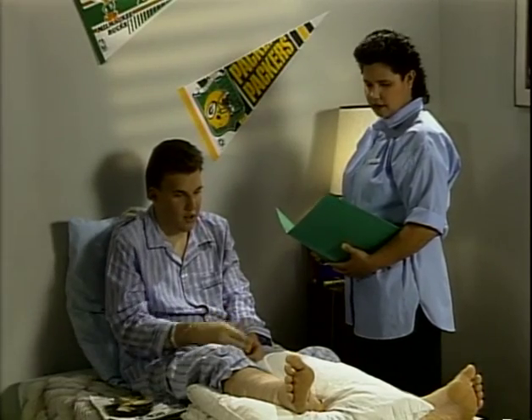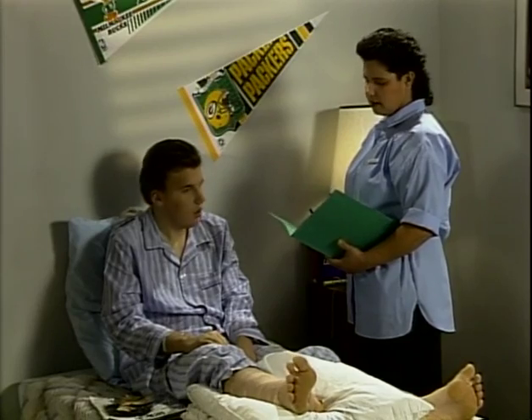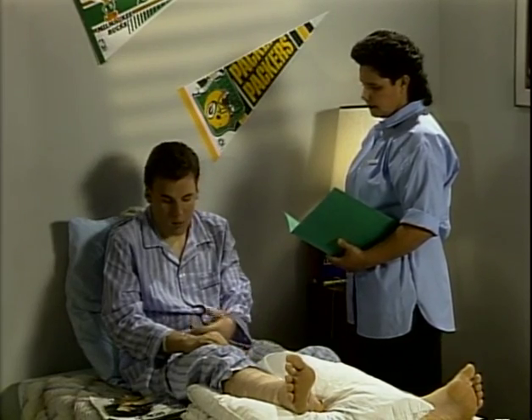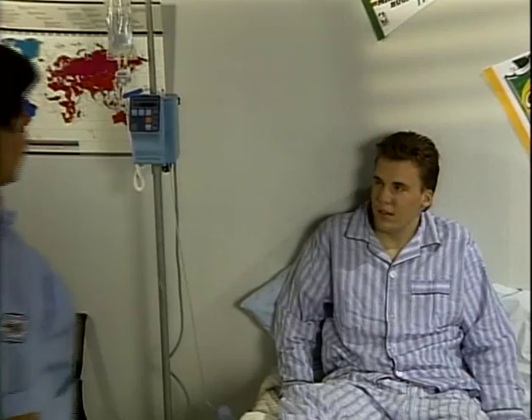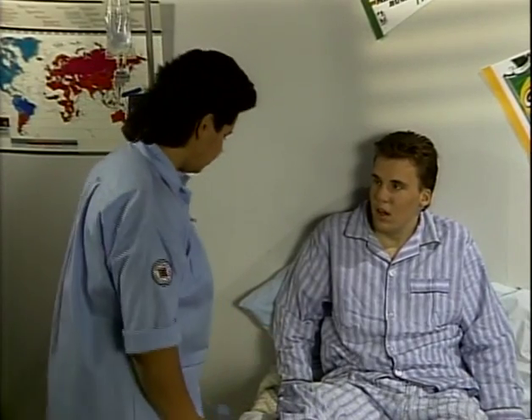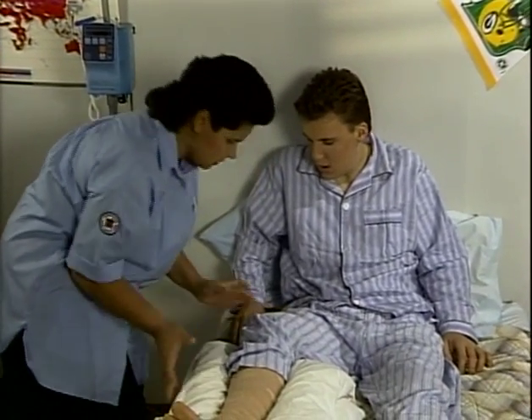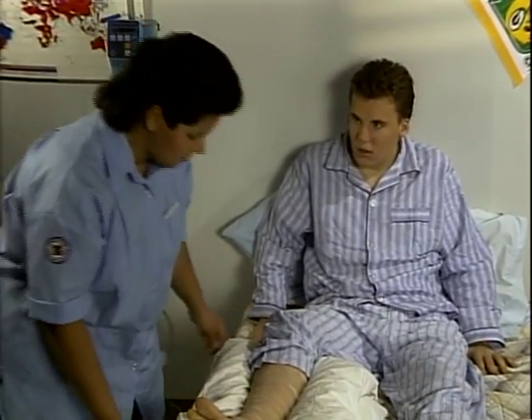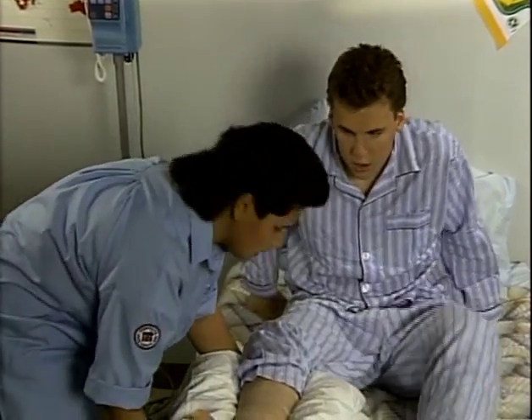He cannot bear weight on his right foot because of the injuries, so the doctor has ordered bed rest with bathroom privileges. Nancy, the registered nurse, has assigned Norma to help John with personal care activities, such as a bath and oral hygiene. Norma will also assist John to the bathroom. Because Mrs. Williams started the antibiotic infusion before leaving for work, Norma will care for John while the solution is infusing. As Norma assists John to reposition, she recalls the precautions she learned about.